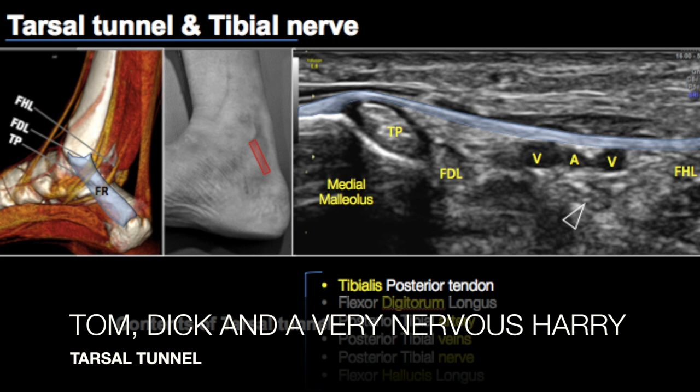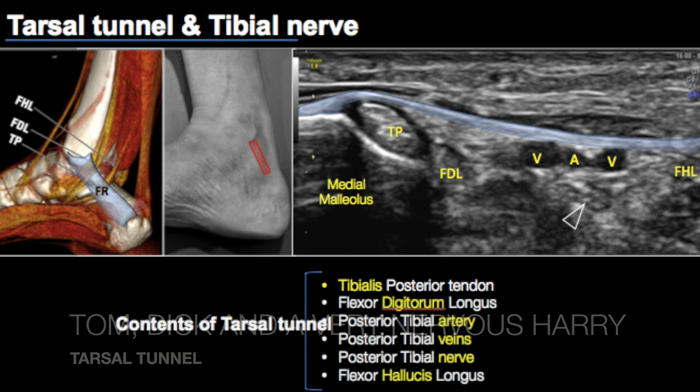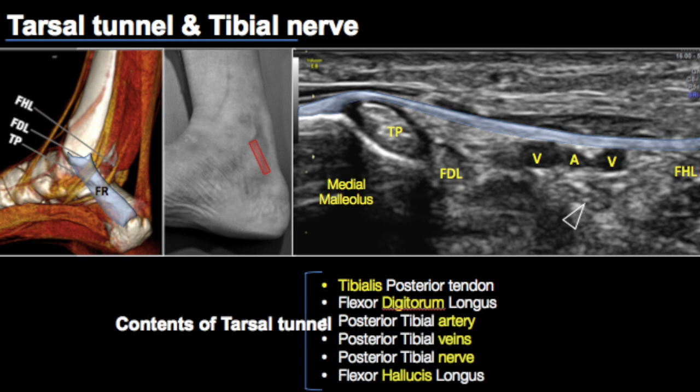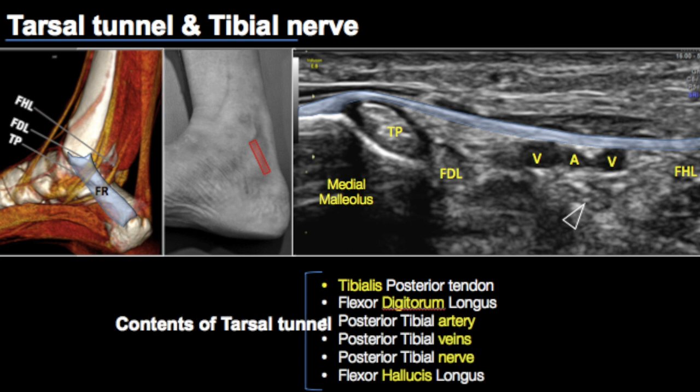This tunnel is formed by the flexor retinaculum, which spans between the medial malleolus and the calcaneum. On the short axis, this is the flexor retinaculum and these are the various structures seen. If there's any ganglion cyst, varicosities, or any soft tissue lesion, this may result in compression of the posterior tibial nerve and result in neurogenic symptoms.